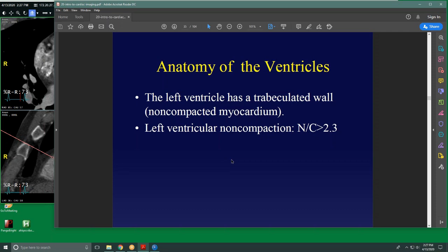So you can just acquire throughout the entire cardiac cycle, and often you'll get better images doing that if they've got an arrhythmia. You go backwards and say, okay, we gathered all these images, we have the EKG, and afterwards you reconstruct the images only at the appropriate phases of the cardiac cycle. You know what I mean? Good. Thank you. So you only put the images together based off of when the heart's quiescent. The other way, where you only gate your acquisition, reduces radiation exposure. But if somebody's got an arrhythmia, their heartbeat's not very regular, that can be problematic, and sometimes you just want to get the entire cardiac cycle.